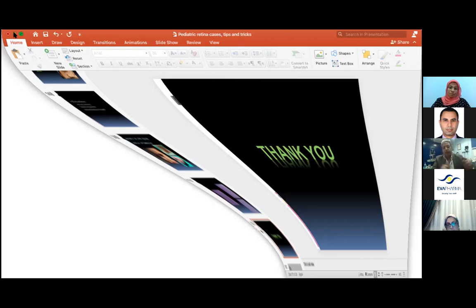And I see the potentially active Coats where you can see a flat retina and a macular exudate and maybe the grayish nodule that is proven to be a choroidal neovascular membrane. The group we described, who published the paper, did a surgery in one of the elderly patients, and this grayish nodule that was referred to in the literature was a choroidal neovascular membrane. And this is for me a sign of activity.